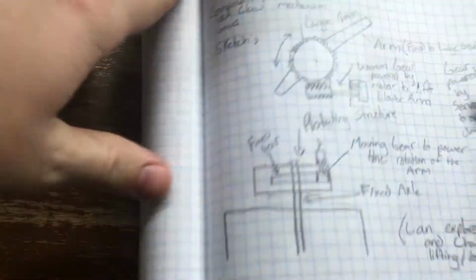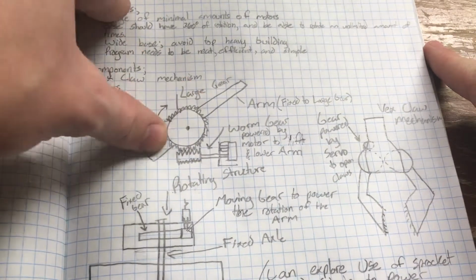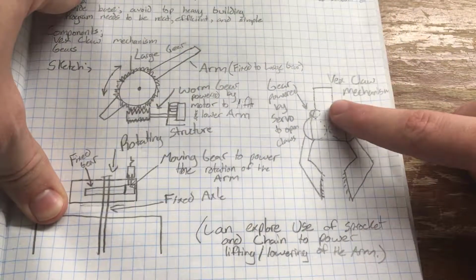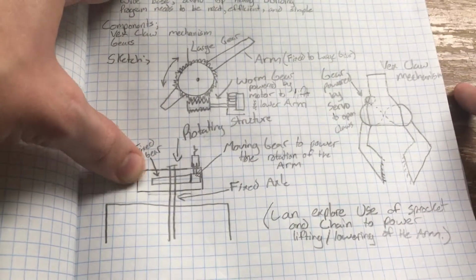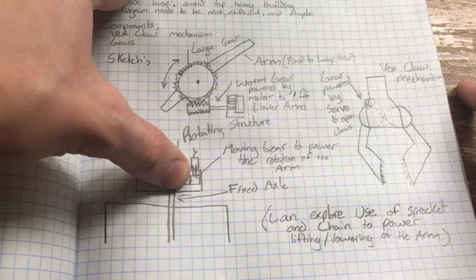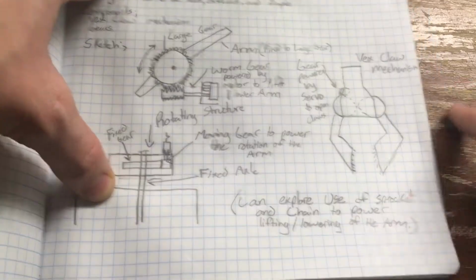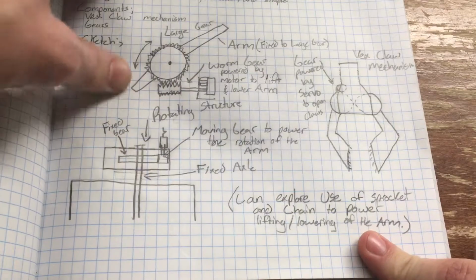We have some preliminary sketches that we started with before we started building. They included the idea to use a worm gear with a large gear and a big plate to use for the arm, to use a servo with a small gear to power the VEX claw, and a rotating base that rotated with a small gear attached to a motor around a fixed gear attached to the bottom base. And then we can also explore the use of a sprocket and chain to power the lifting and lowering of the arm instead of a worm gear.